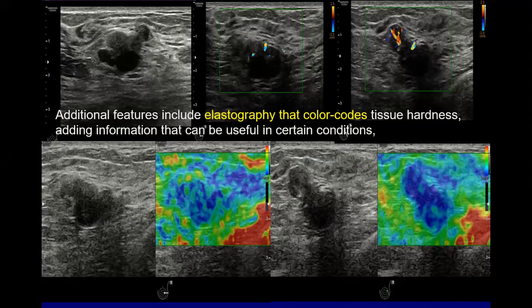And one of the differential diagnoses we mentioned was that the patient could be having fibrocystic changes. We put fibroadenomatoid changes as one of the differentials, and it was proven pathologically.